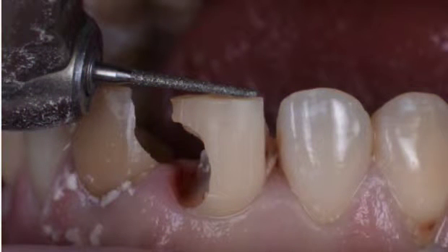Some images, and now you can see a real problem from the mesial aspect of this tooth from the periodontal point of view, and also from the isolation point of view as well. We offered the patient a crown lengthening procedure, but the patient was afraid of any surgical treatment and asked us to avoid all stuff with scalpels, blades, and something like this.